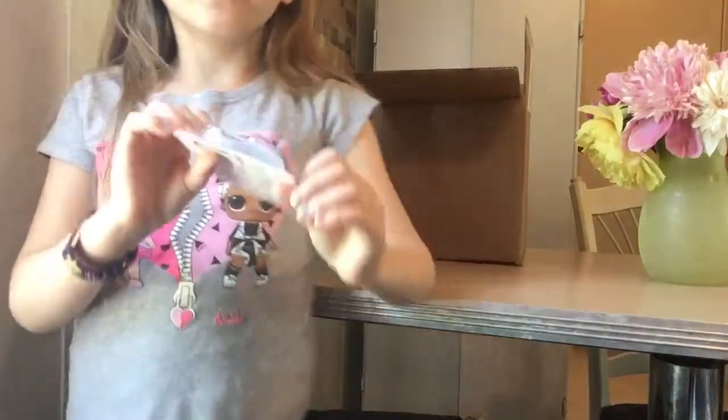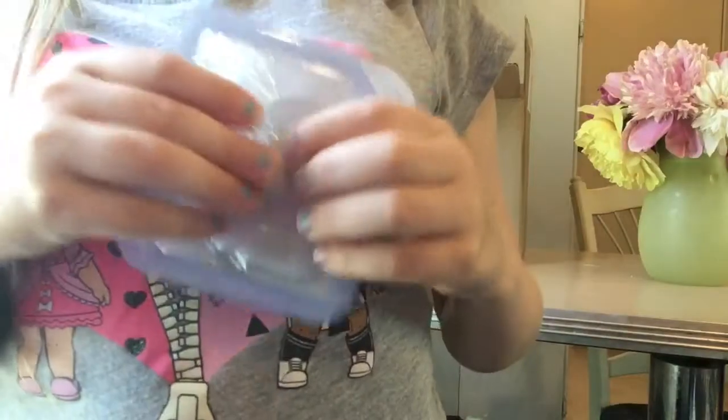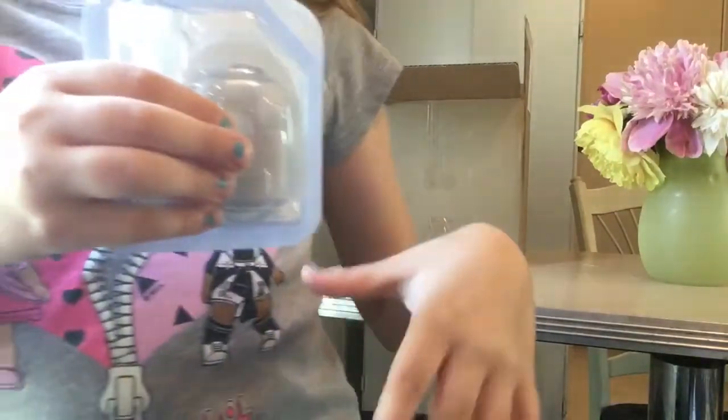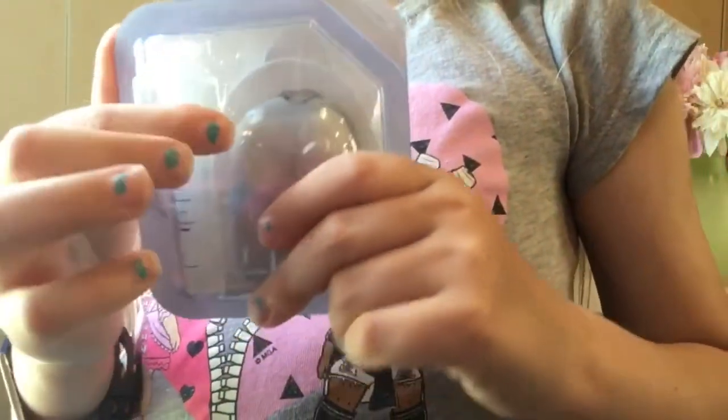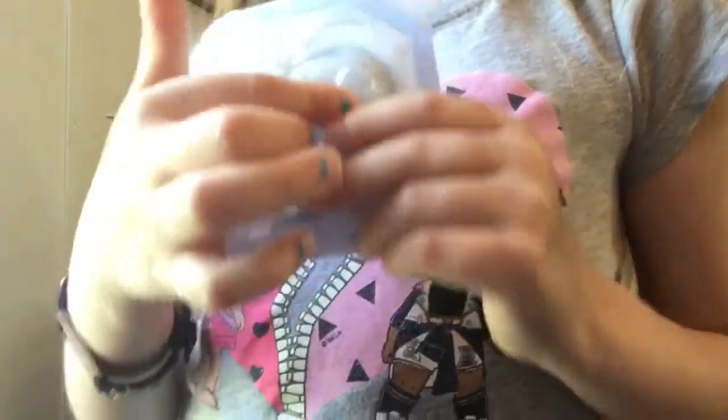So the first thing is the pump. I'm so glad that I don't have a tube, because that would be so hard to sleep with — it would probably get jerked out. I guess this is where you put the insulin and stuff, and then put it in here.